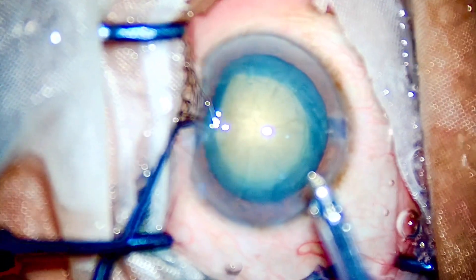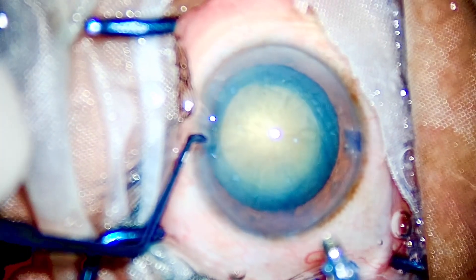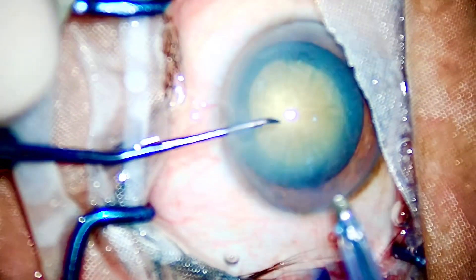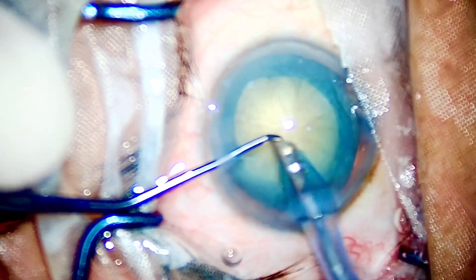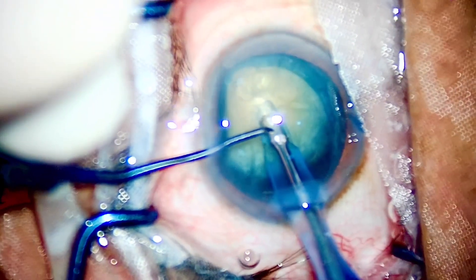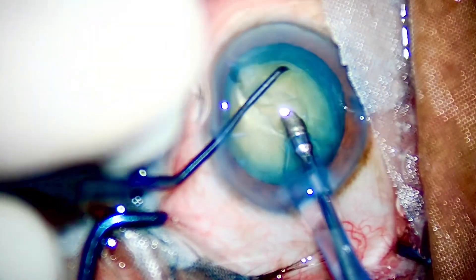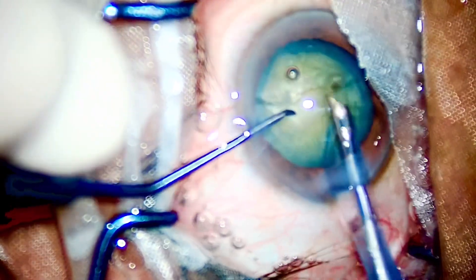I have some difficulty locating the side port — the patient is a little uncooperative and not able to fixate his eye on the light. I'll go in with the chopper first, then phaco, irrigating one last time before entering the anterior chamber — and down, down, down into the endonucleus: phaco 3, phaco 2, and chop — just like that. I have made two hemi-nuclei with the same famous modified vertical chop.